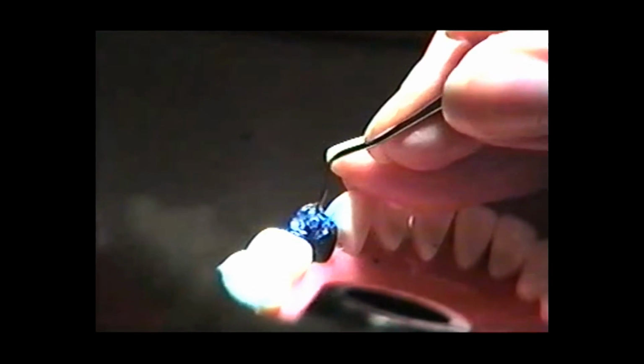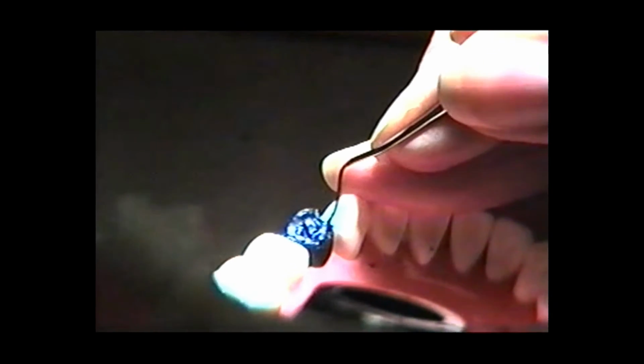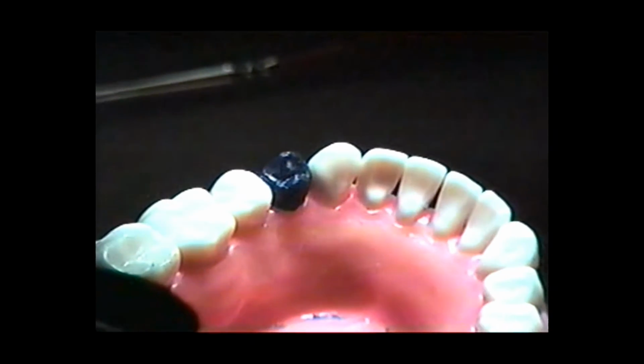I'm using just this instrument sideways, like this, so I get the central groove right to where I want it to be. Then once I get that, I'm going to get rid of this extra wax that I have here, and that's where the white end of your brush works really well. Just brush it out of there. Now you can see I've got a little bit of a groove pattern there, and we're going to refine that.